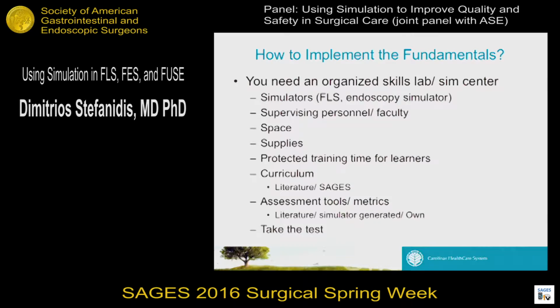For someone who's new in the simulation arena, the usual thought process is, I'm just going to go get the simulator and that's going to take care of it. And all of us who've gone through that phase early in our career know that that definitely is not true. So you don't just need the simulators, you need a lot more things to make the simulators have value in the training of your program.